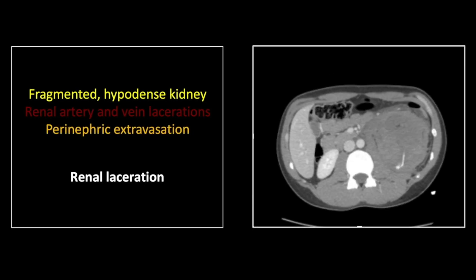Yet more inferiorly, you can see an anteriorly displaced, devascularized, hypodense left inferior kidney. Essentially, this is a renal transection, both through the left renal vessels, but also through the mid-portion of the renal parenchyma.